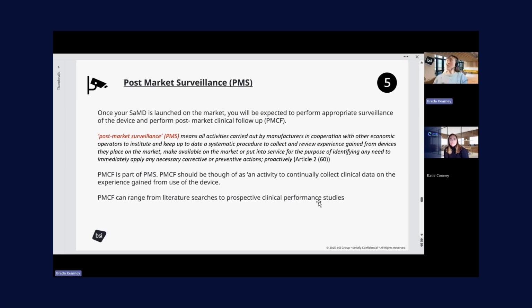So you're looking at all of your complaints, your vigilance data, you're going out talking to your customers and the clinicians that are using the software, gathering feedback, constantly screening literature, looking at what's happening with similar devices. You may need to do some PMCF studies to gather new clinical data, and it's just about gathering data generated from use of your device in the real world. And then you feed that data back into your clinical evaluation and use it to update it.